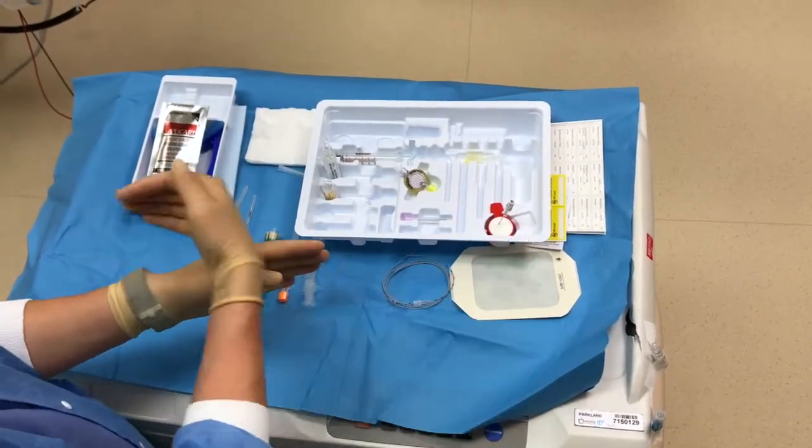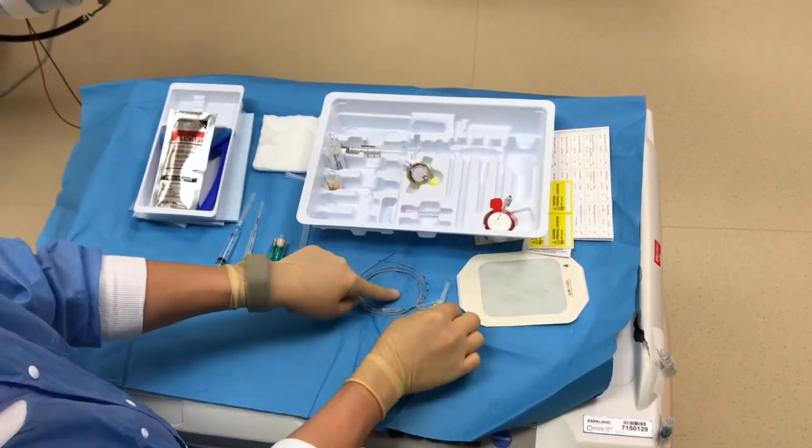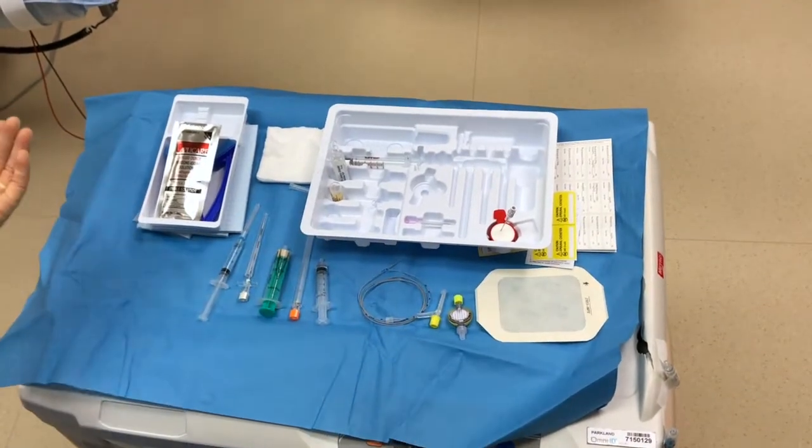After our spinal dose, we would thread the catheter. And then this goes at the end of the catheter. I'll demonstrate that later. And then the filter goes beyond that. So that's kind of a basic setup.